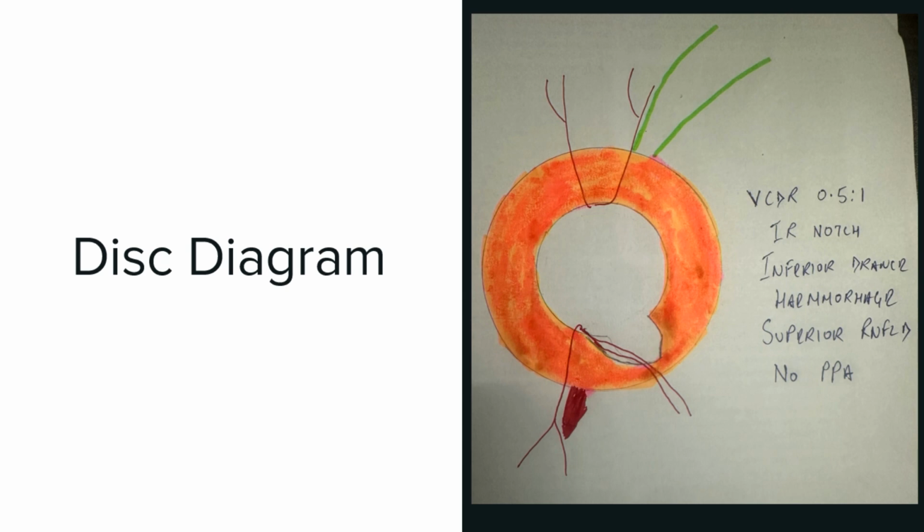What else is missing? The size. You have to mention the disc size, whether it's small, average, or large. So detailed disc drawing recording is very important, especially in the absence of photography and all. So it still holds good even today.